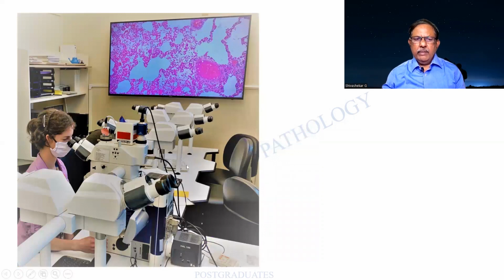This is another picture. You must be aware of the pentahead and the decahead microscopes, wherein all the pathologists at a center throw in their ideas. Simultaneously, it could be connected digitally so that the picture is sent elsewhere and an nth person is also able to give his expert opinion, so that the entire team can benefit. Also for conferencing and for questioning, this could be useful.